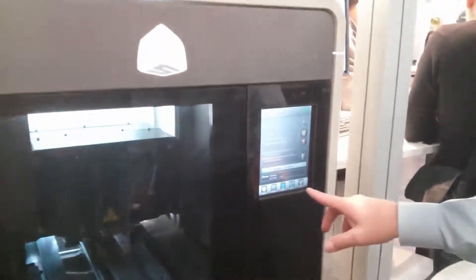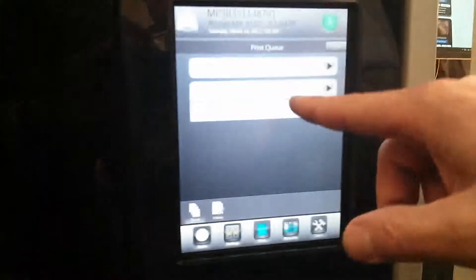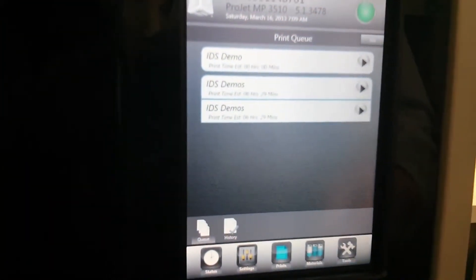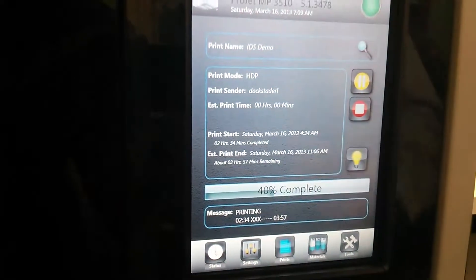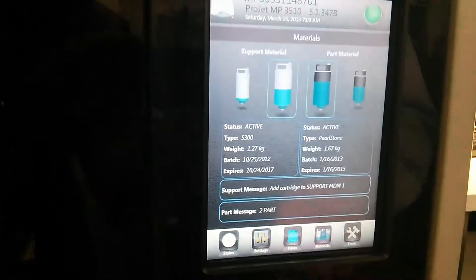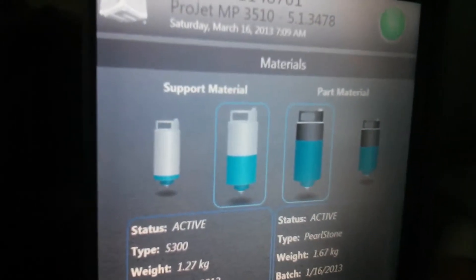There's also a new touchscreen interface. You can look at the print queue, submit the jobs to the machine, pick which job you want to do, and then hit print. Simple as that. It also monitors the material and the usage. It empties one cartridge and then pulls into the next one.